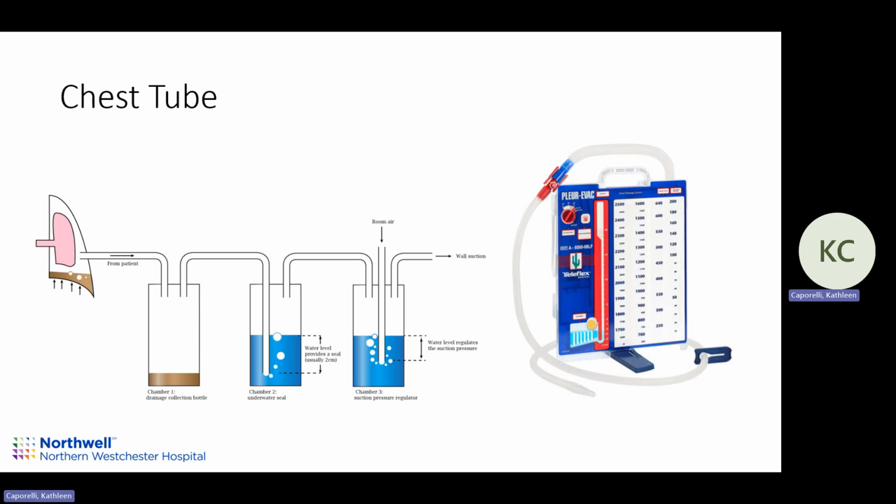And then this thing up here sets the pressure. So you hook up the suction somewhere. I think there's one of the things over there. There's a little nozzle where you hook up the suction, and you can crank the suction up as high as you want. It doesn't matter because this will regulate the pressure.